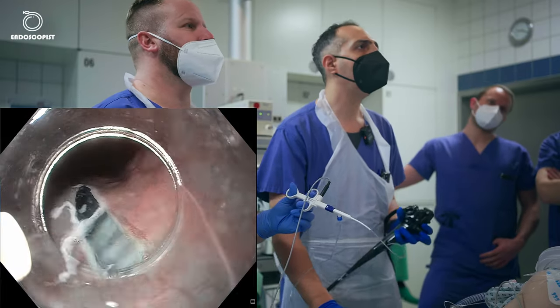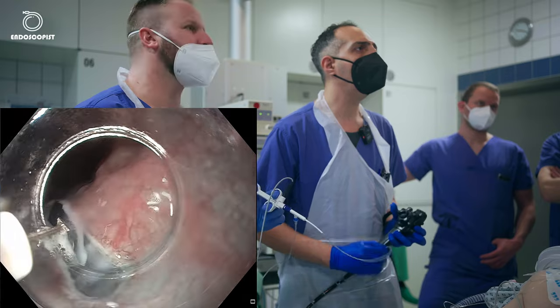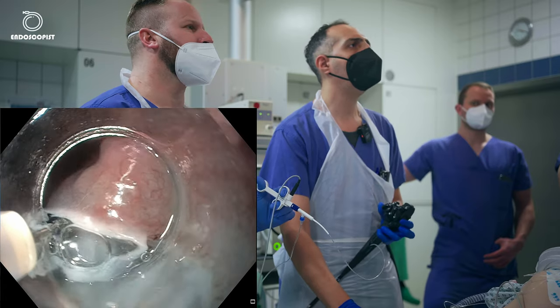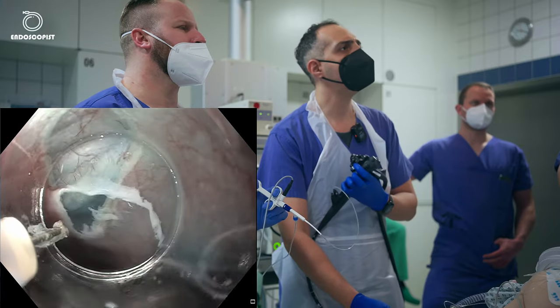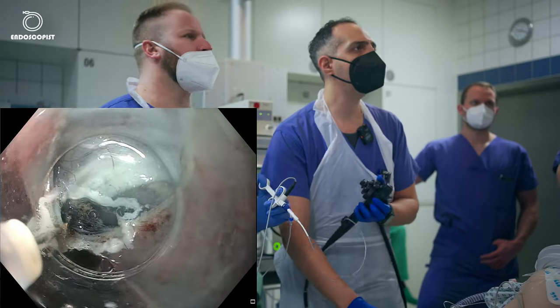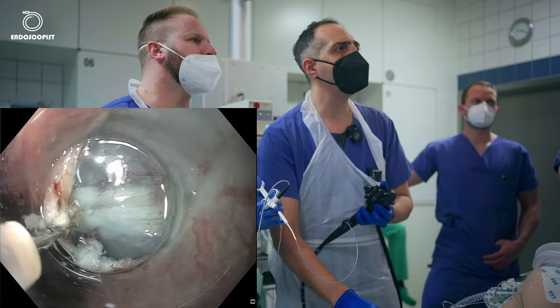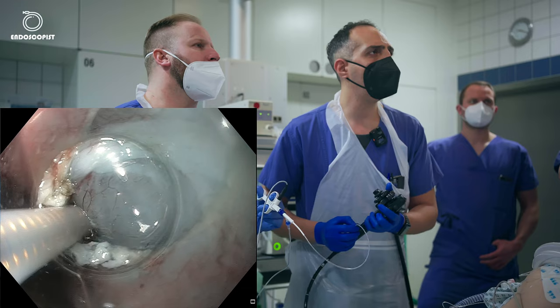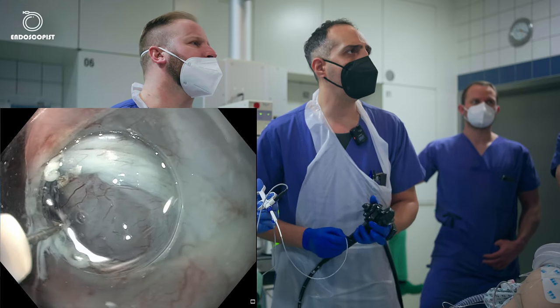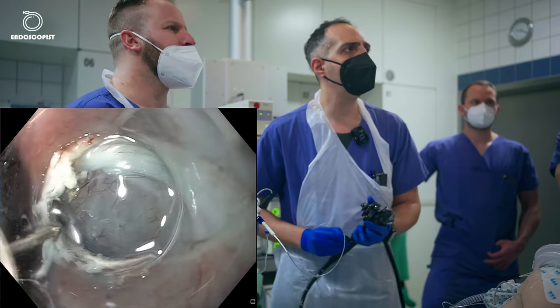And now we'll try to dissect the submucosa a little bit to open the tunnel. Now I will use spray coag. Opening the tunnel can be one of the toughest parts of the POEM because afterwards everything will be much easier. I have to keep the muscle layer here in this area intact.